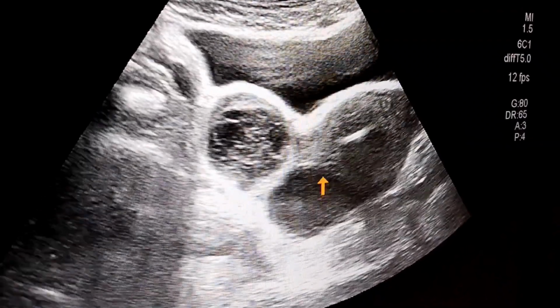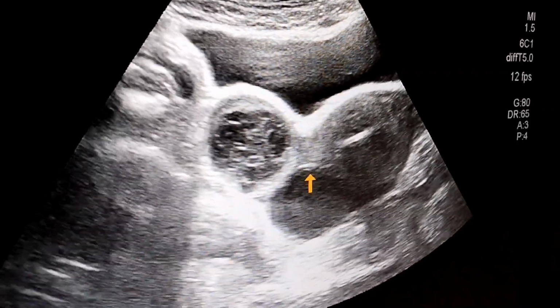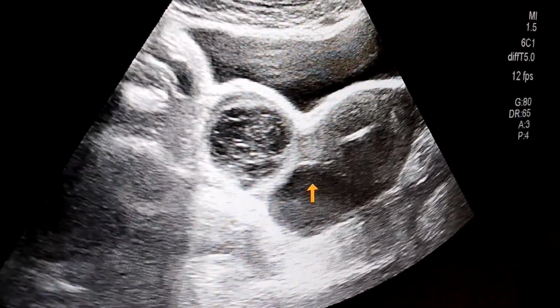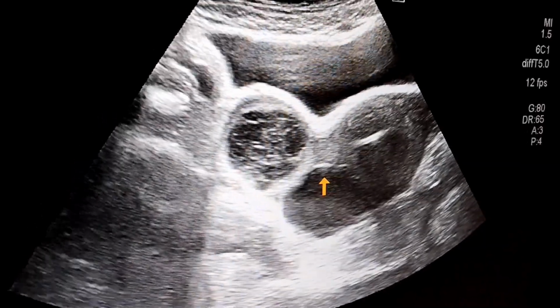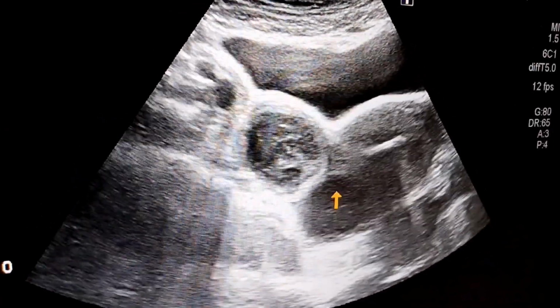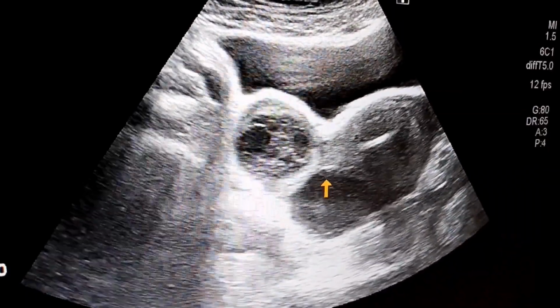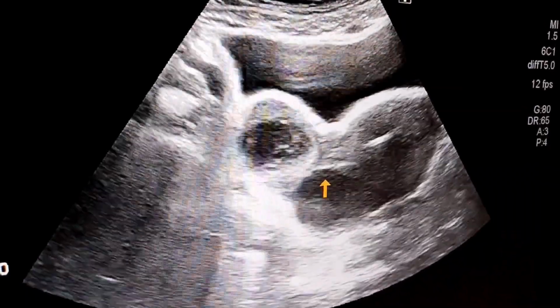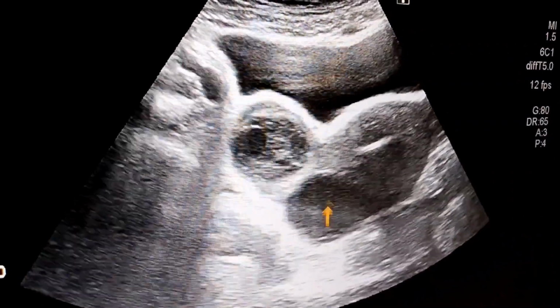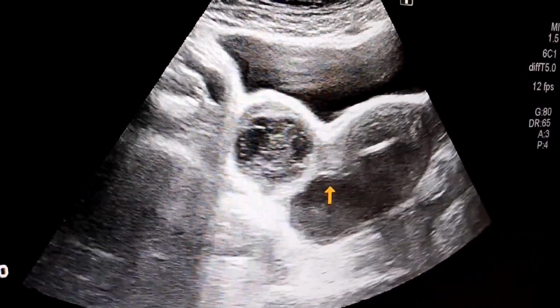So this lumen should be filled with that low level diffuse echoes, while we can appreciate here the fluid debris level. So this is the main characteristic feature of the endometrioma, that diffuse low level ground glass appearance of the cyst.